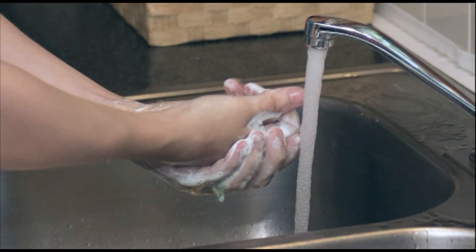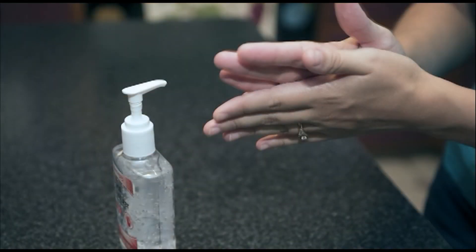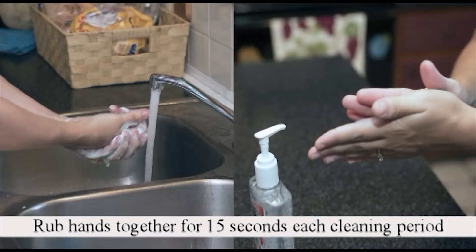Wash your hands thoroughly with soap and water, or scrub your hands vigorously with a hand sanitizer. Rub your hands together for 15 seconds each cleaning period, whether you use soap or hand sanitizer.